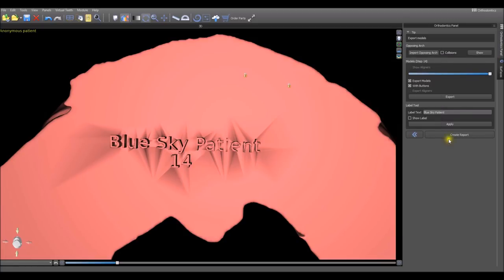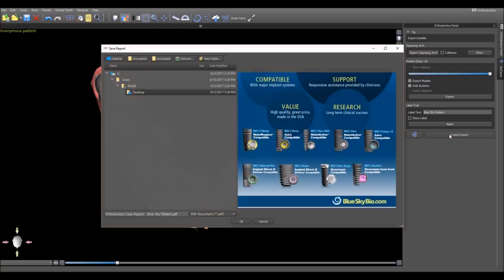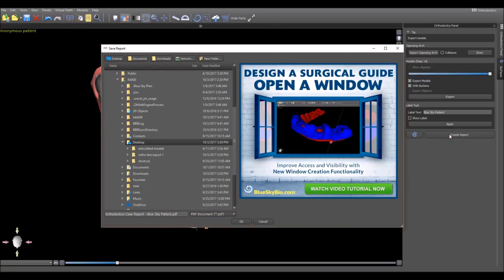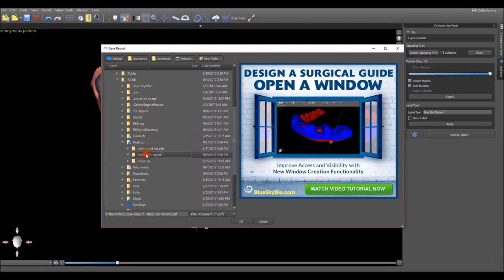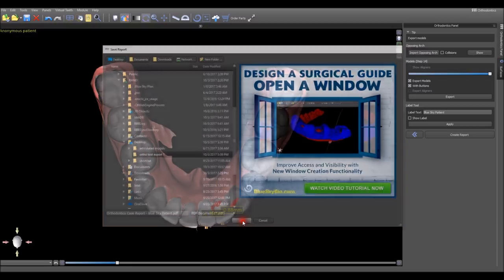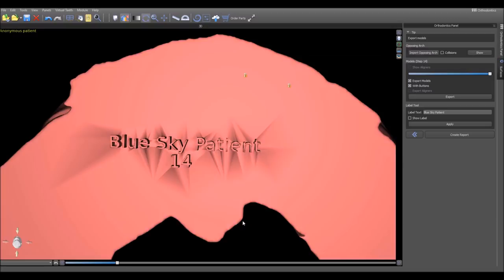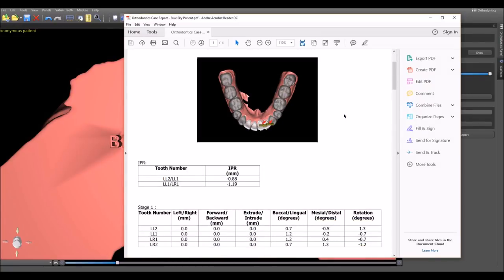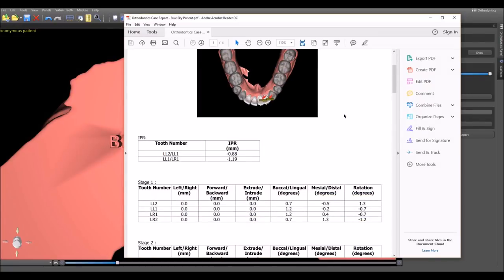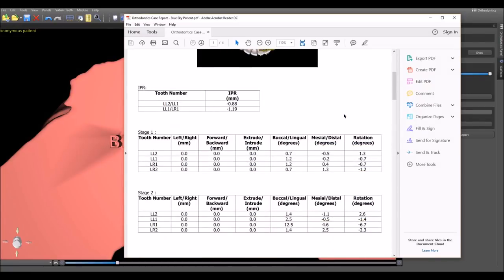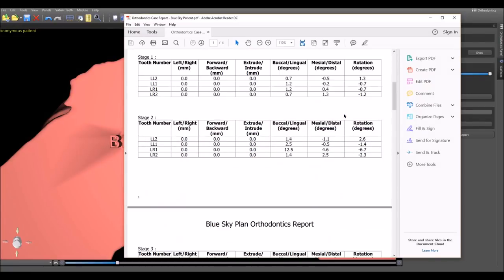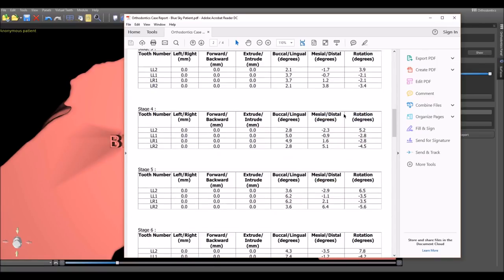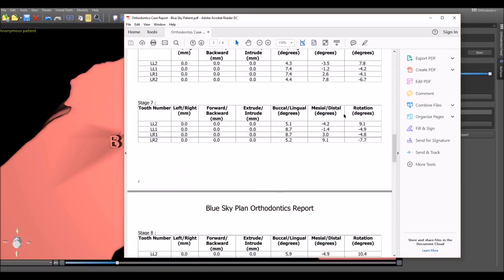If we press the create report button, the software automatically creates a report for the case. It asks where we want to save it. Let's go ahead and put it in the same folder as our models. The report shows us the IPR values and the movements of each tooth at any given stage.